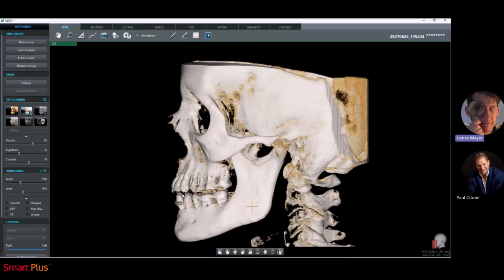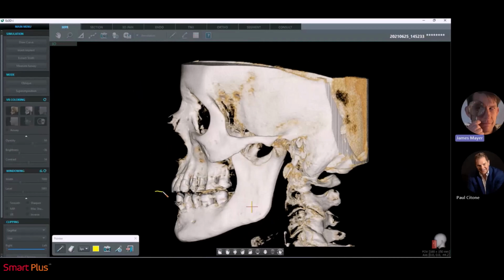That's why it's very important, like we talked about when we were doing our patient positioning, to ensure that the patient is positioned and their occlusion is flat or parallel with the floor, because the scatter only streaks horizontally through there.